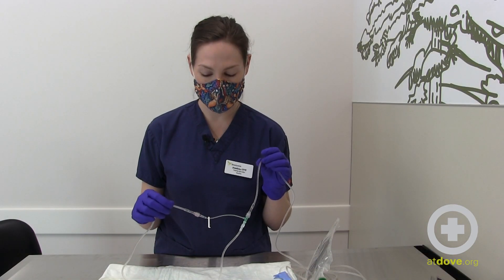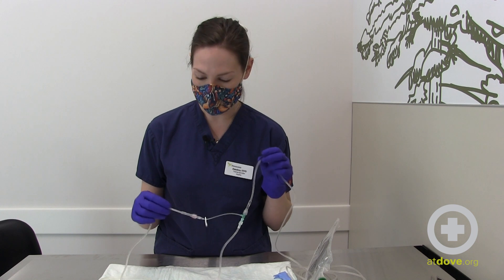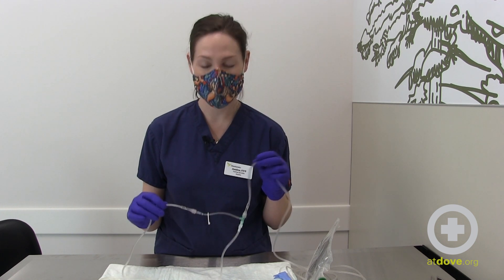Another thing to remember is to bleed your lines so you don't have any air in them — I have a lot of air in these because they were used sets. And that is our technician hack. Thanks!